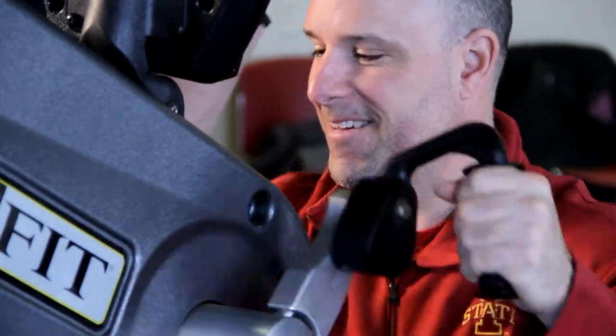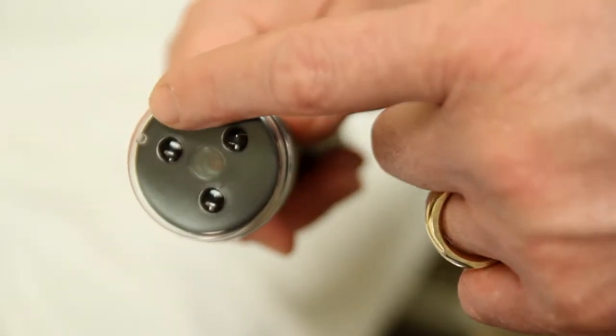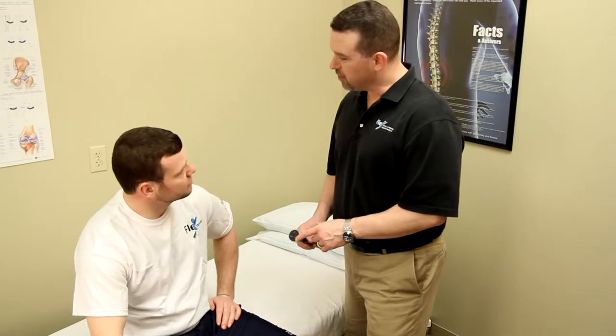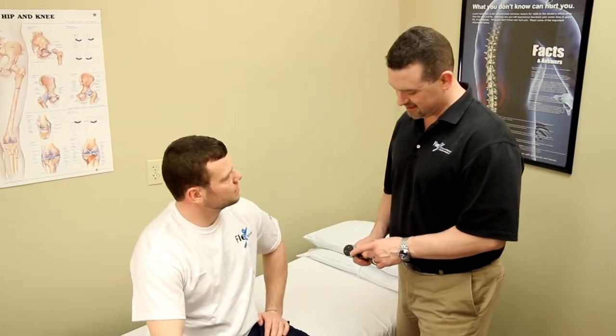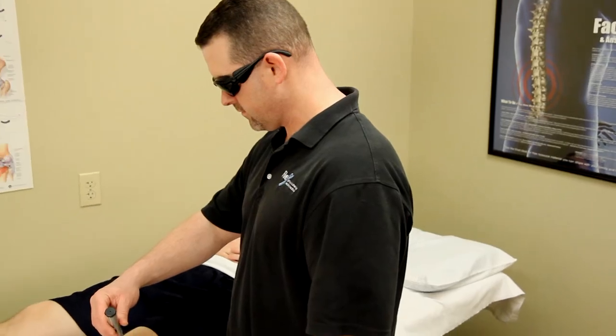At Flex Physical Therapy & Sports Medicine, our goal is to get you back to normal as quickly as possible. That's why we use techniques like our 830 Laser Therapy. Low-level light finds injured tissue, energizing cells to help reduce pain instantly while jump-starting the healing process.